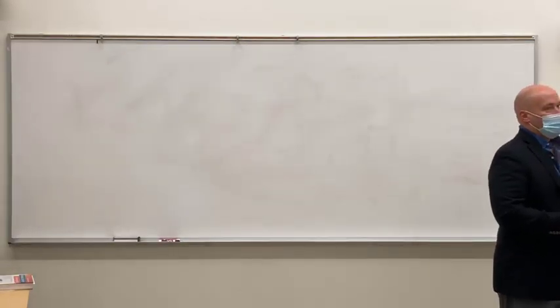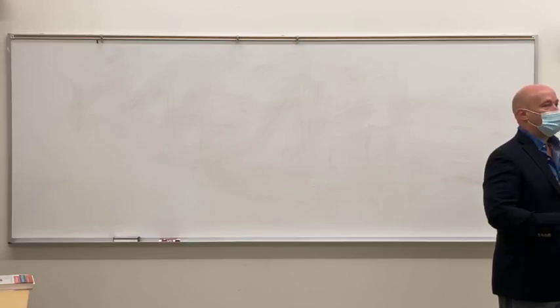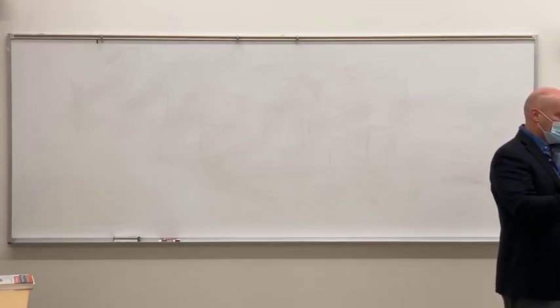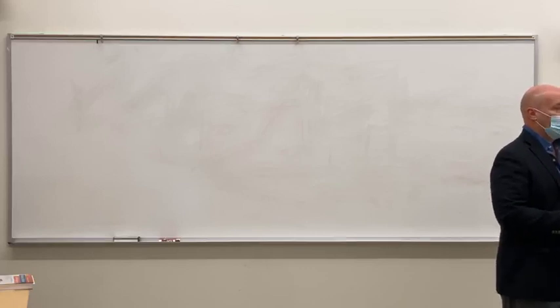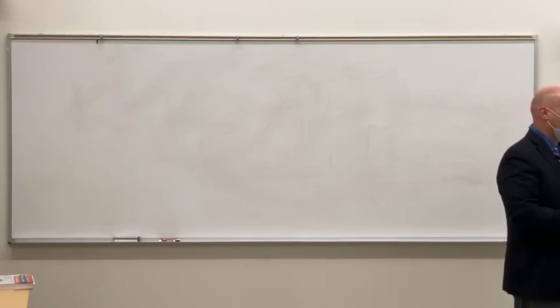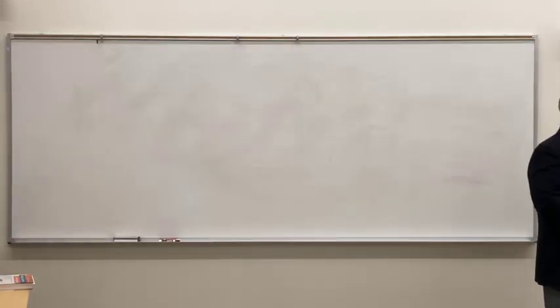By the strictest definition, it really recognizes the mAs because it's counting the photons basically. But it can't tell if you use a high kVp or low kVp. And that's kind of the spirit of the question: does it differentiate high kVp and low kVp? The answer is no.